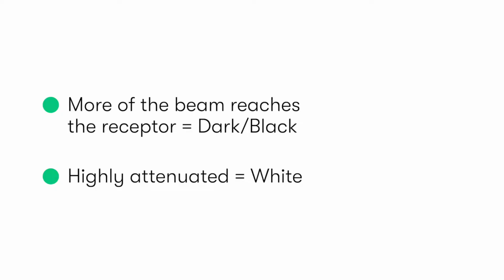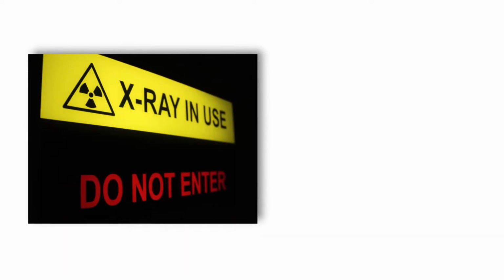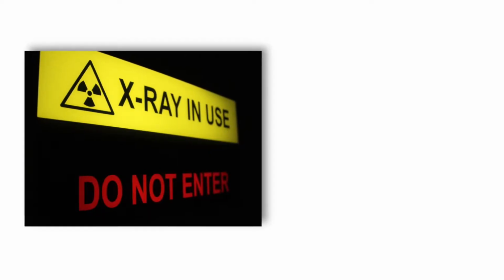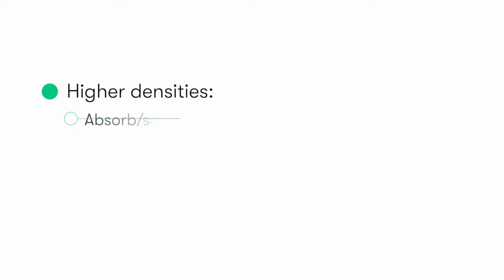Now obviously, the fact that some of this radiation does get absorbed by the patient isn't a great thing. However, the amount of radioactivity that is absorbed is only very small, and nowhere near enough to make our patient radioactive.